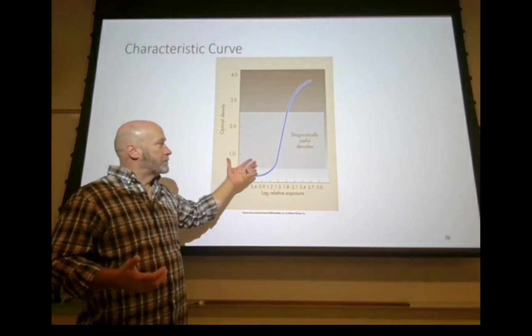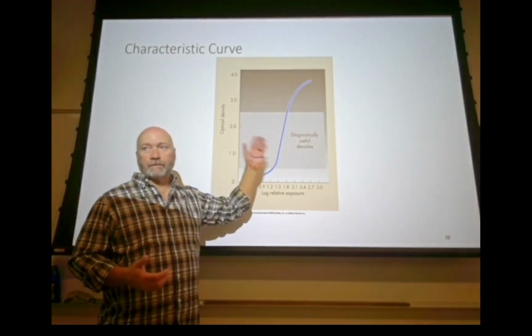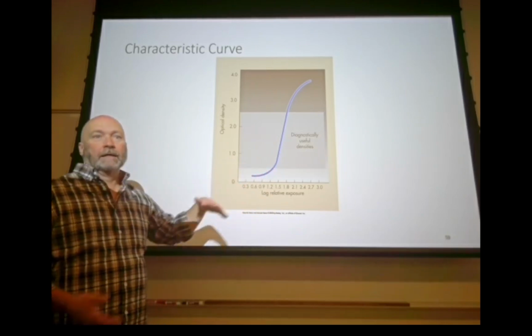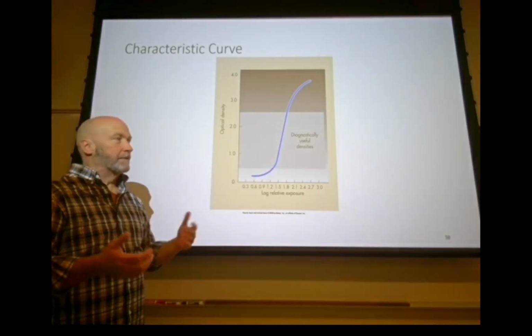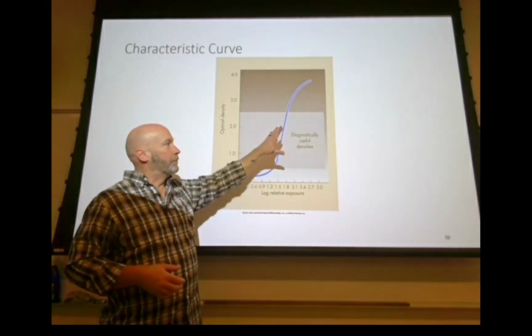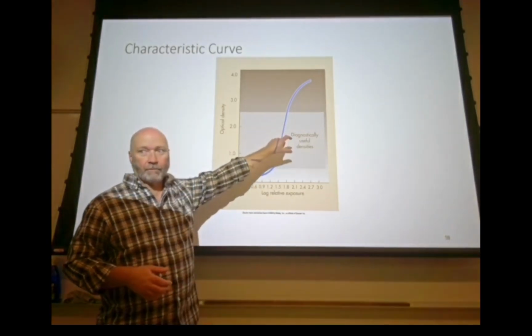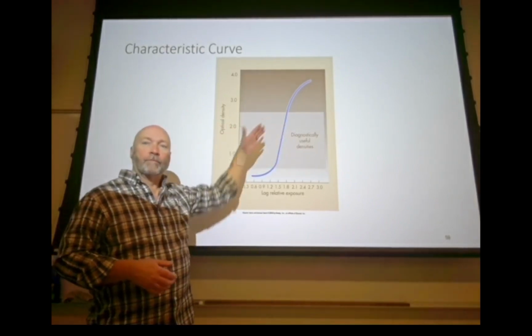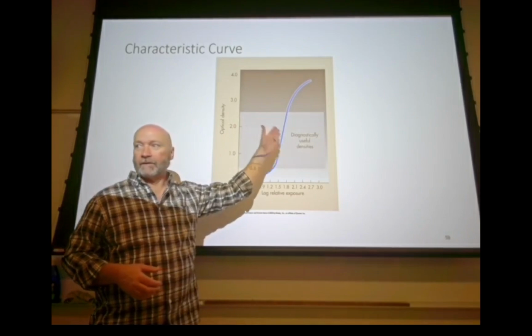So most of the time, high contrast is going to be high speed, and low contrast is going to be lower speed. But they're still going to be pretty similar. And again, a more vertical curve, where the useful densities are the straight line portion of the curve, the more vertical that is, the higher the contrast is.